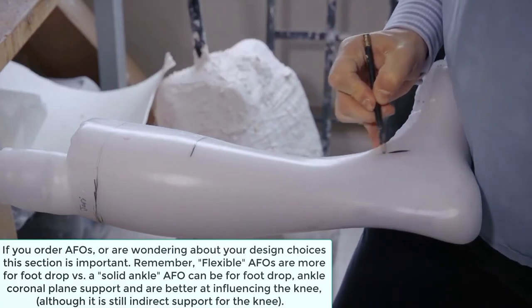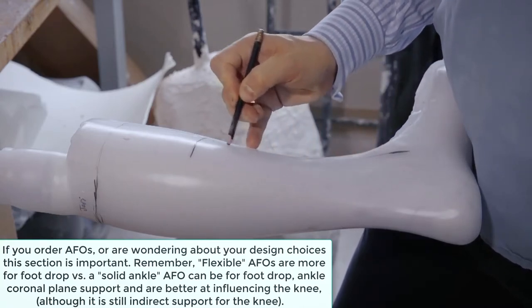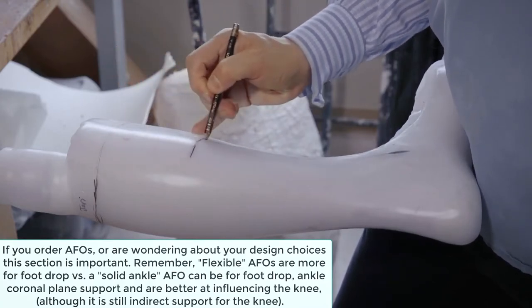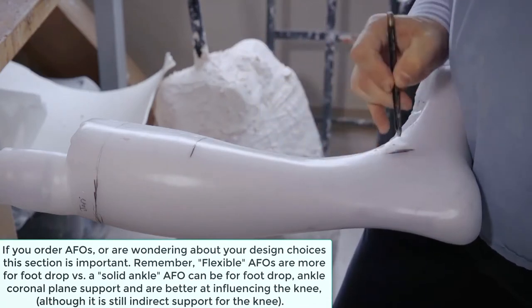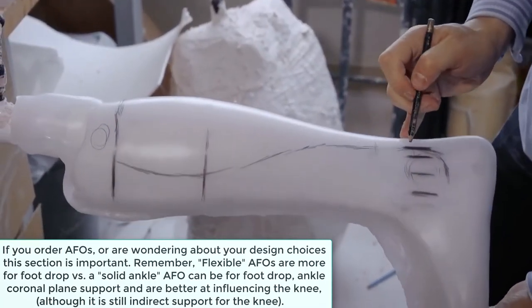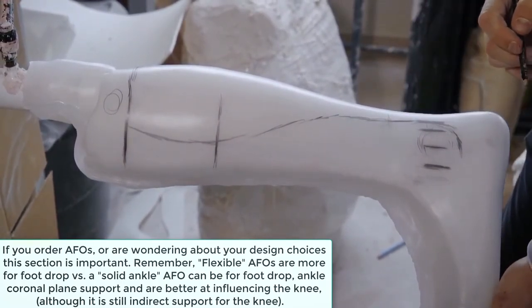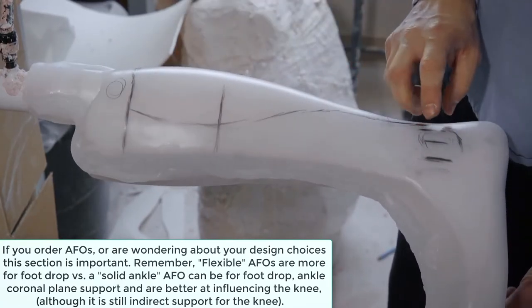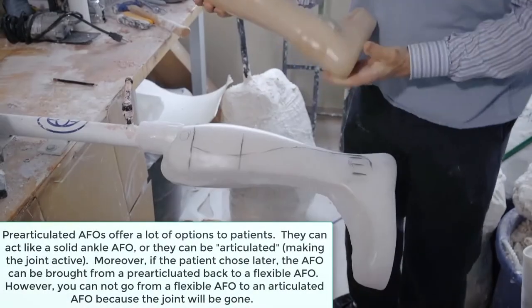So I'm going to draw now the trim lines for the solid. It would come up like this. Very different in its approach. And then usually there's a little bit of a flare here like this. Okay, so you can see the difference. It's in front of the ankle bone here, whereas back here, this would be the flexible. So more or less foot drop. Oftentimes, we can include a joint in a brace, and it begins in what we call the pre-articulated stage. And I'm going to show you one of these real quick. Here's another AFO right here.